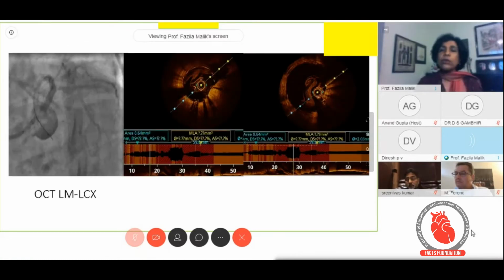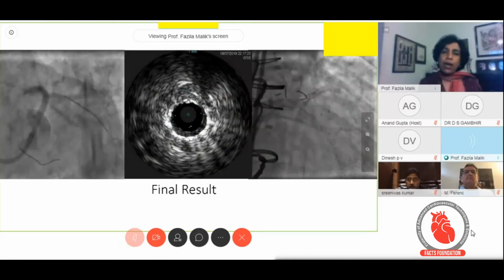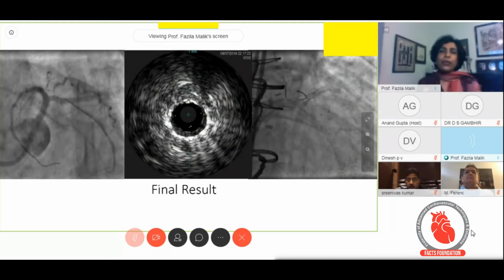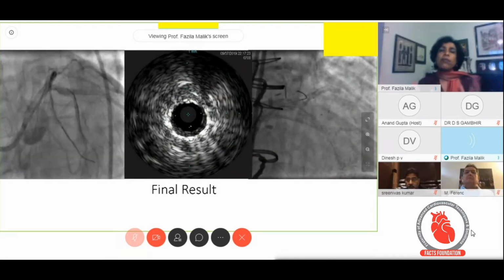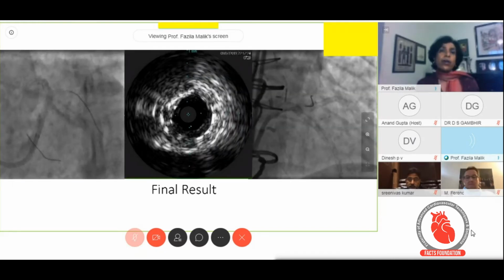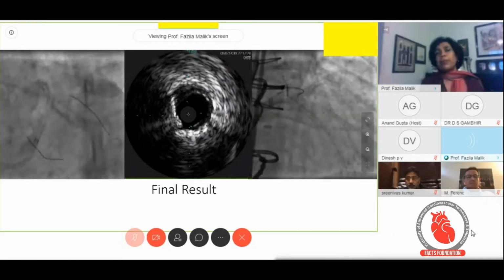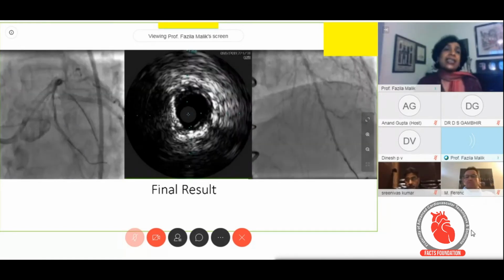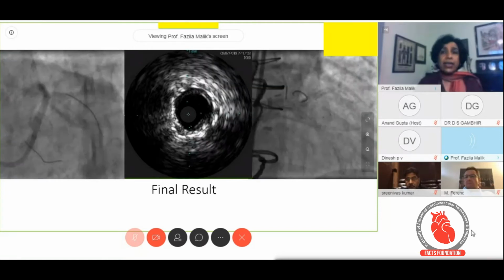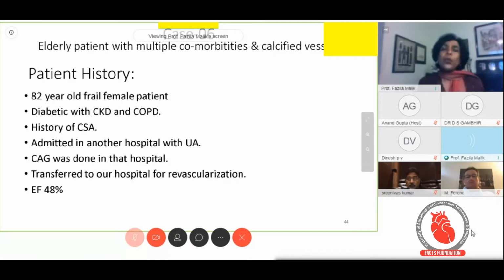We also did OCT as this was a live case that we are doing. I'm sorry, I don't have the moving pictures, but we also did IVUS as one of the panelists asked, and we could see that the ostia of both the left main and the LAD were properly covered and were well open, and the left main looked just fine. And this patient has been doing very well, which shows the DK crush in the long run, in many cases, does work. Now, that was one patient where the stent design came into play.